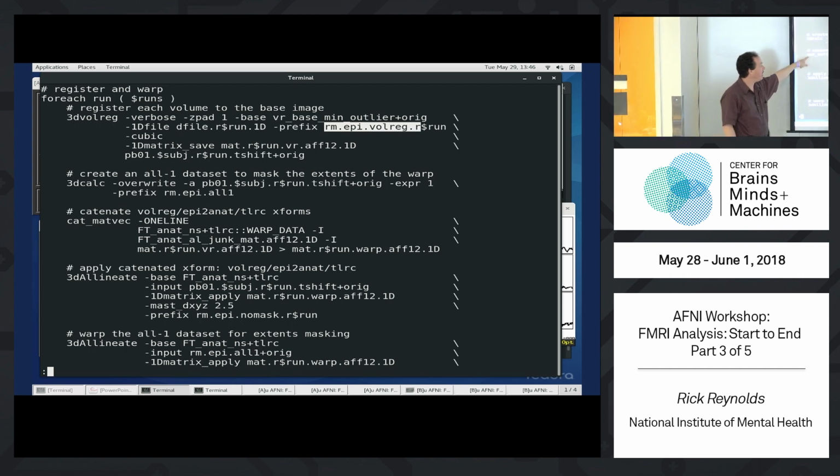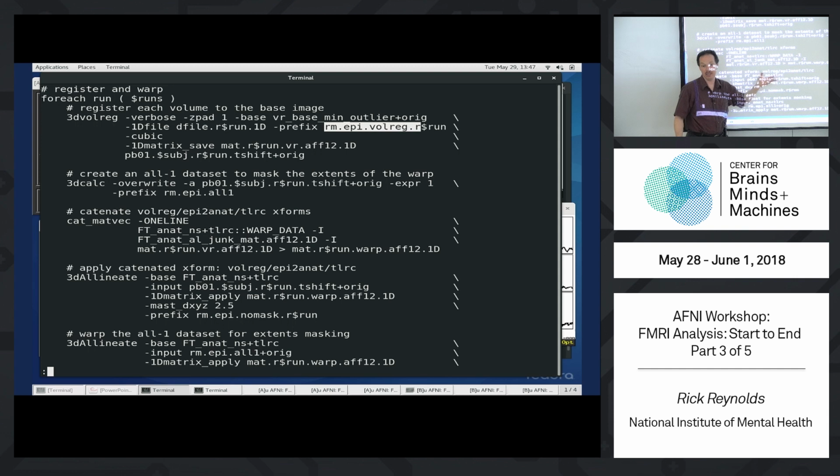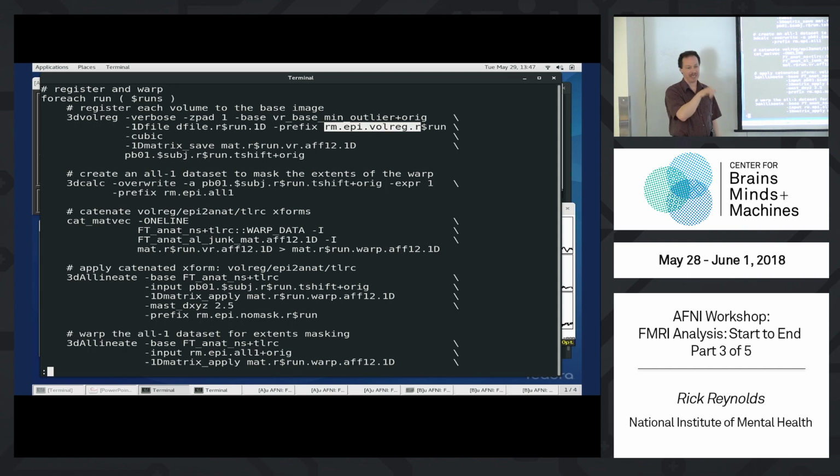Like the matvec command, you can actually invert transformations in this to make a new file and then apply that file. But Daniel's got a few examples of how to do this, and the surefire way to do it is to ask him. I think even in the registration talk you have. It's in the ROI talk. Oh, in the ROI talk. So you'll do that later.